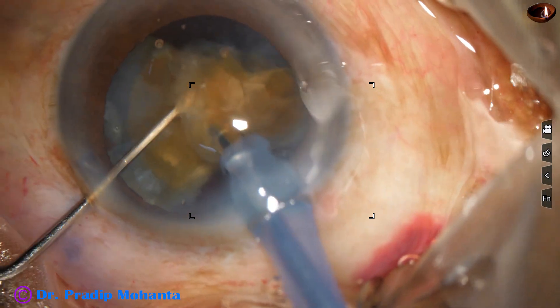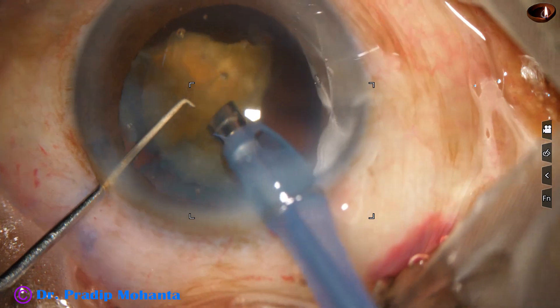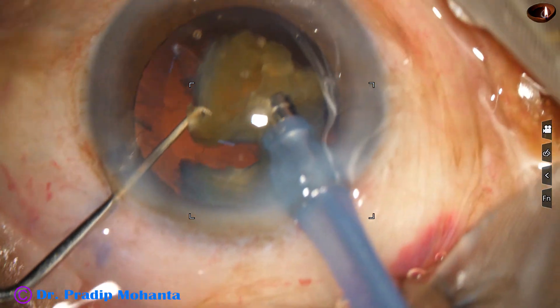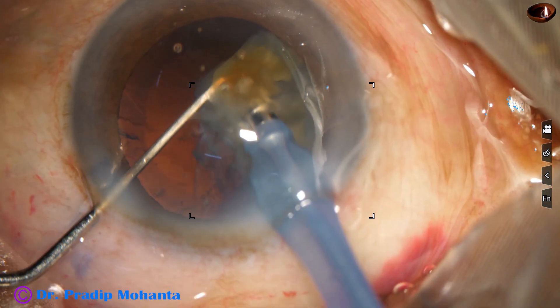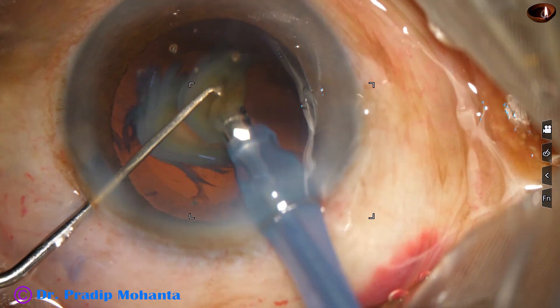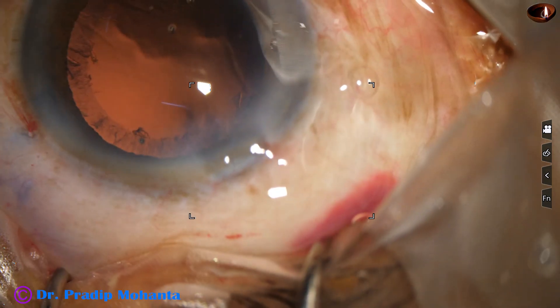In this case, the anterior chamber is very stable, the posterior capsule is far behind, and I am sure that the cornea is quite healthy in this case, though the patient is very old — about 78 years. Now this is the last portion of the last piece. At this time, the parameters are reduced for safe emulsification of this last small piece.